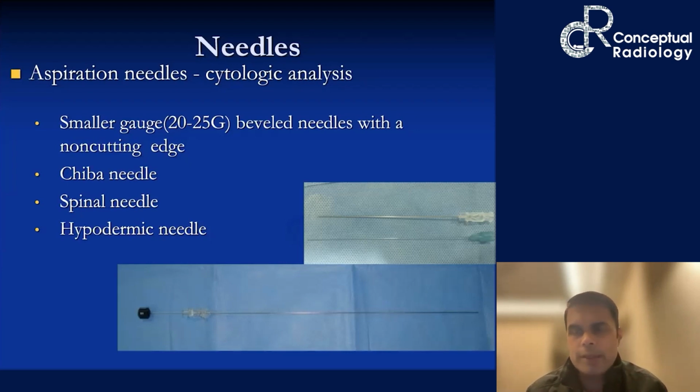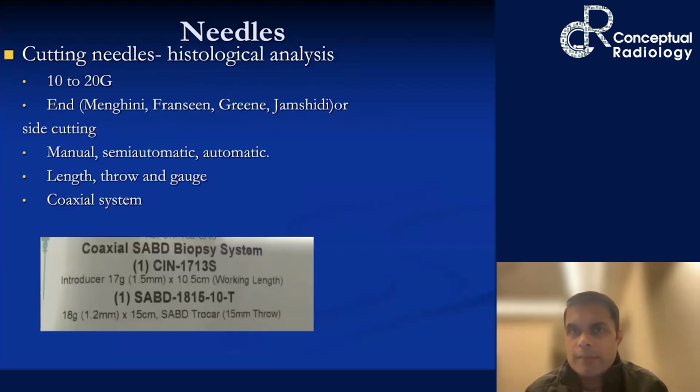So we have to use these aspiration needles. Then come the cutting needles for biopsy. So basically, the idea behind biopsy is that you have to take a bigger piece.